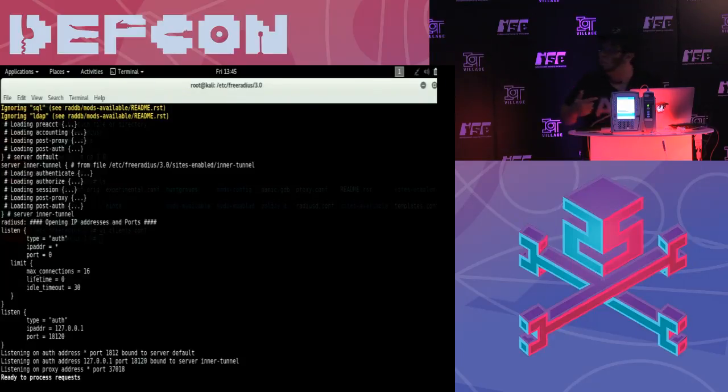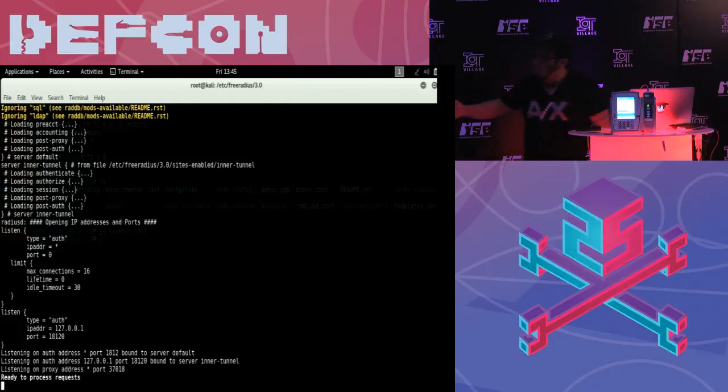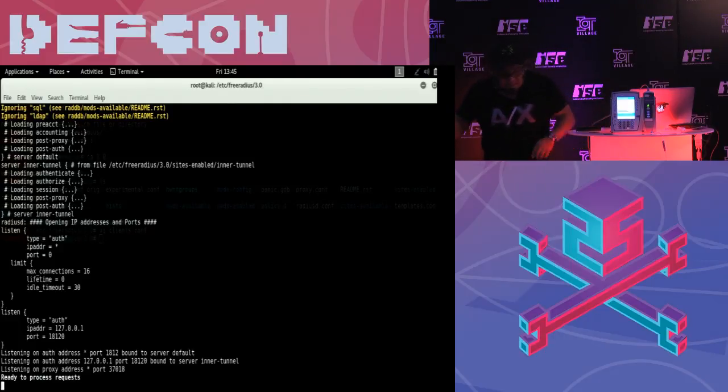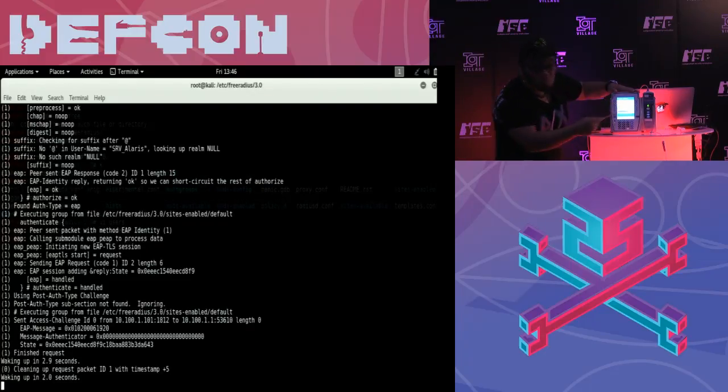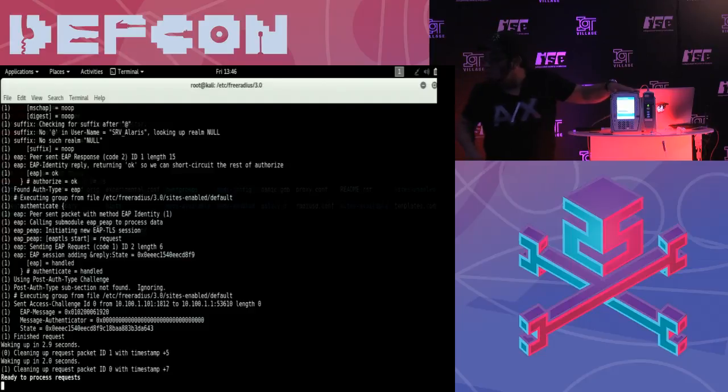So here is my radius. The radius is running now. It is going to start processing requests. It's going to take some seconds to hopefully get this guy authenticated because he's retrying and retrying and retrying. So let's see if it picks it up there. It's going to take probably 10 seconds around, or 15, or 20.